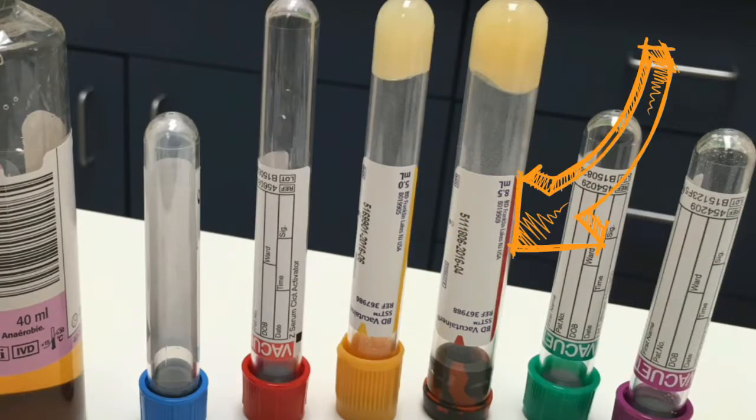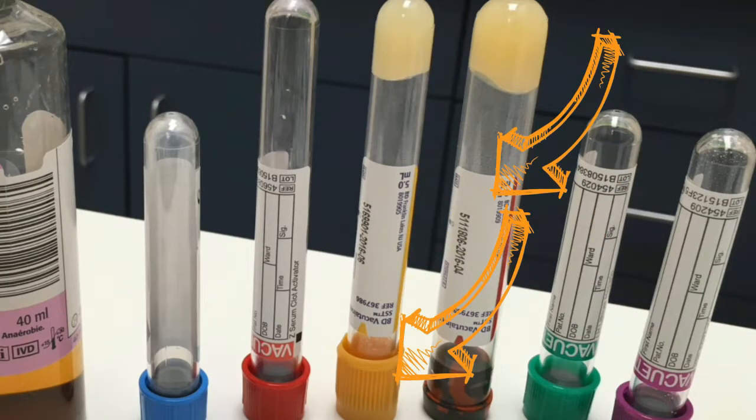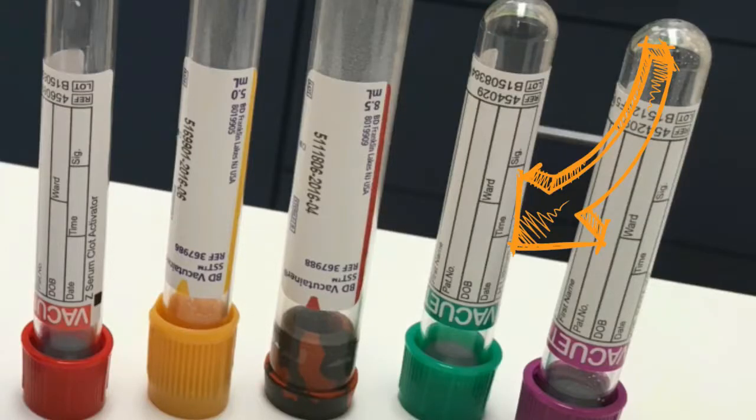The yellow Integra tube contains a gel separator that you must allow to clot for half an hour. These test for CMP, BMP, including a cardiac panel, TSH, free T4, and PSA. The green tube contains a heparin coating. It is used to heparinize plasma or whole blood for special tests.